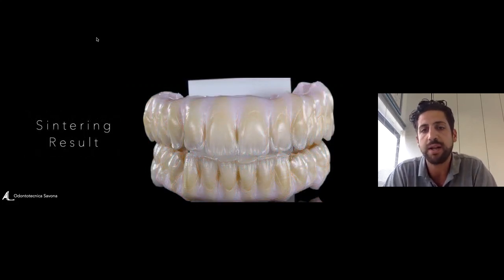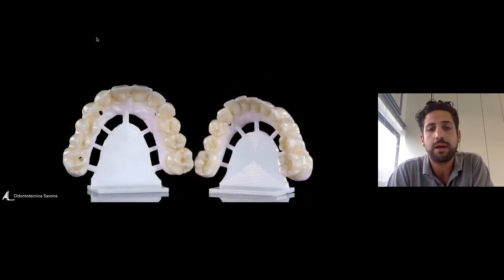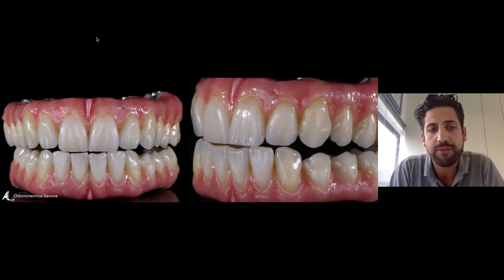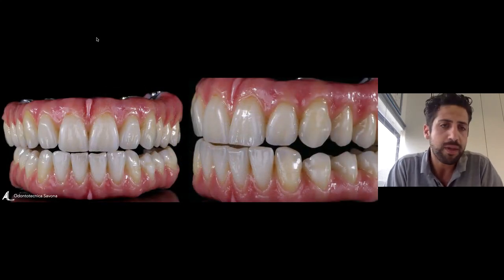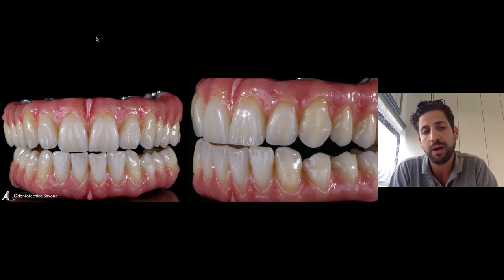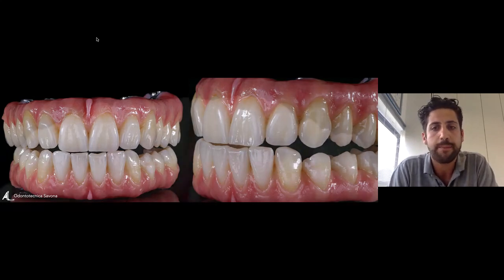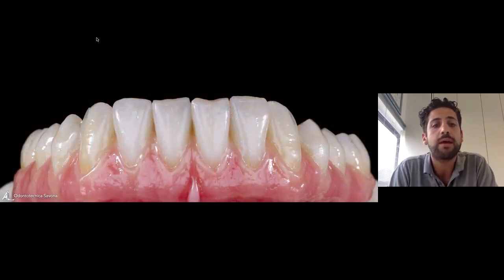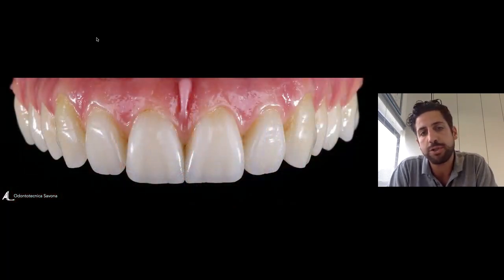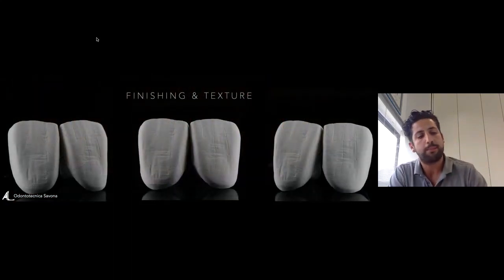You can see immediately the difference. This is an occlusal surface. And this is the result after the buildup of ceramic. You have the possibility to make really natural teeth with this kind of zirconia. This is the lower jaw, and this is the upper jaw. Okay, this was the Prettau 2.